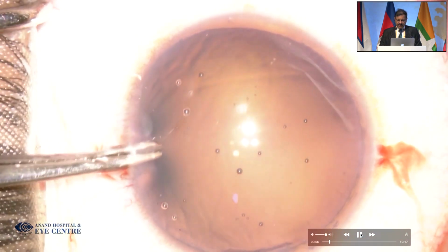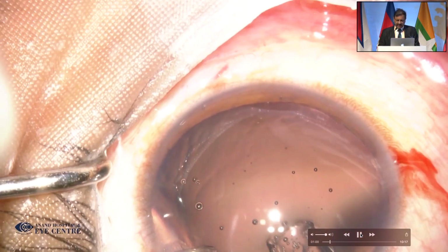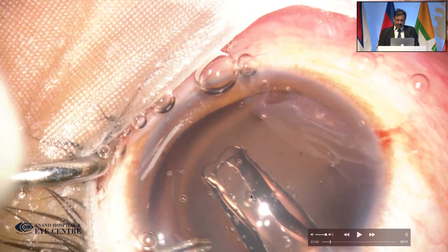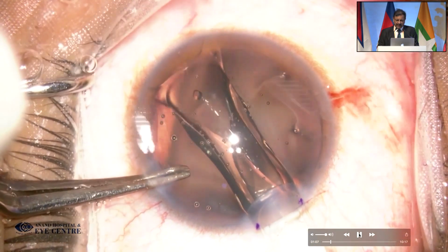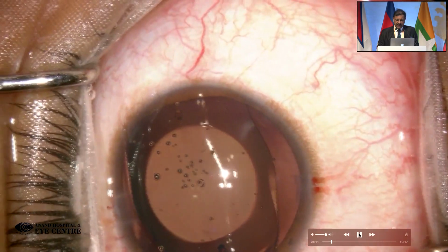And then this is how the lens system goes in. Once we are injecting, what I'm looking at is the 3 holes here. So the optic has these 3 holes, and if these 3 holes are in line, they are aligned, never ever will you have the ICL going upside down. Very gently you have to tap, don't be in a rush to push in, and let the lens unfold.